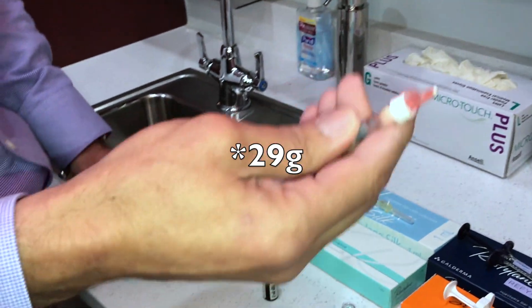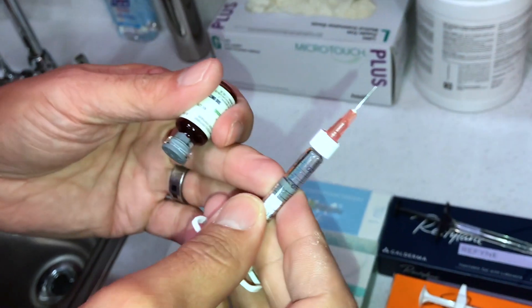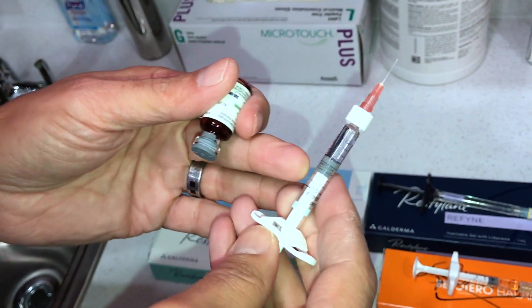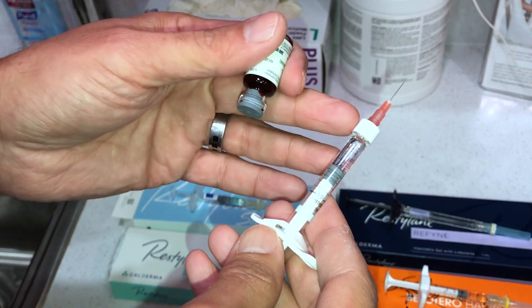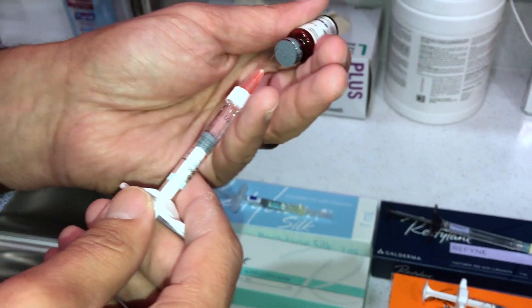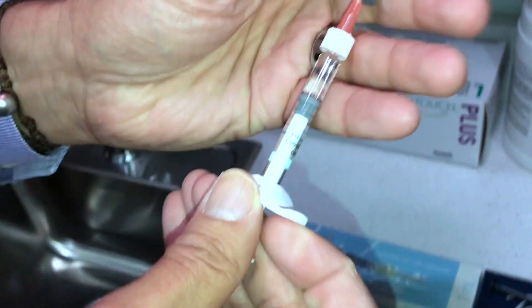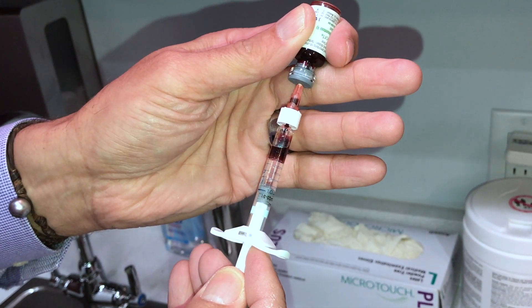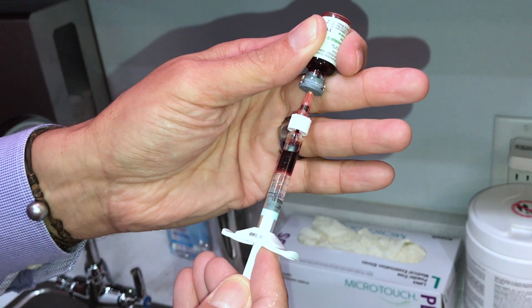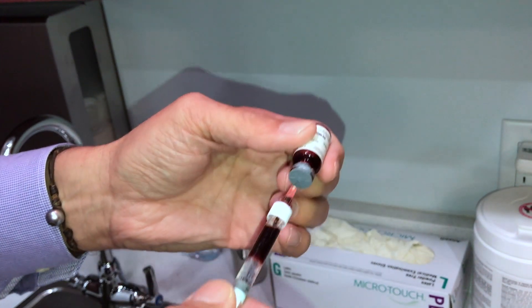I'm going to start with Lift. As you can see, it uses the needle that comes with it — the 30 gauge — and I'm going to see if I can aspirate. Keep in mind this syringe is half full, which means I can withdraw it much further than if it were full, creating a lot more negative pressure. The blood is freely flowing. I put it in, I aspirate, and voila — there is blood coming into the syringe. So it actually works with Restylane Lift.